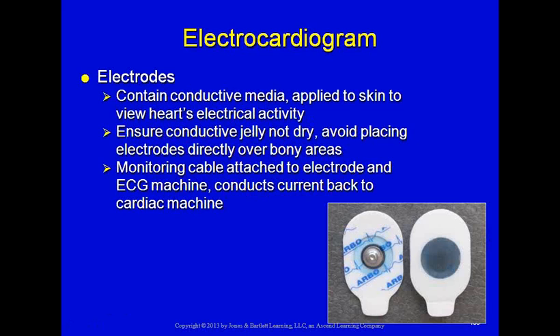allows or picks up the electrical charge much better than if it were dry or if it were placed over a bony prominence. Then we have to make sure that our cable, our patient cable, is attached to the ECG machine or the heart monitor.